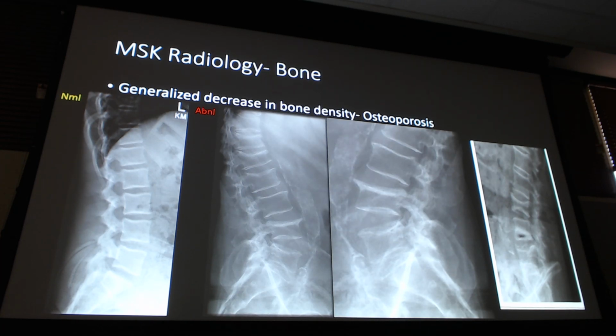So now over time, that weight from holding the weight up just starts to compress that vertebrae down, okay? And then these other two on the other side, these are all abnormal as well, all right? Compressed area, much more radiolucent than my normal. This guy here is starting to do that compression on both sides, right here and right here, okay? Starting to compress on both sides, but still having that radiolucent center. I know you gotta look at them some more, but for now, does this slide stand out between the normal and the abnormal?